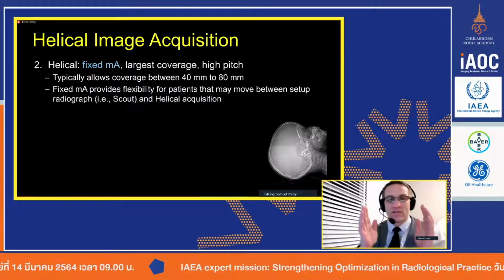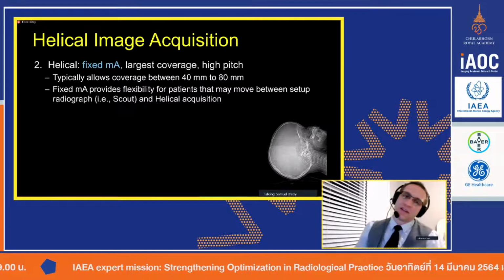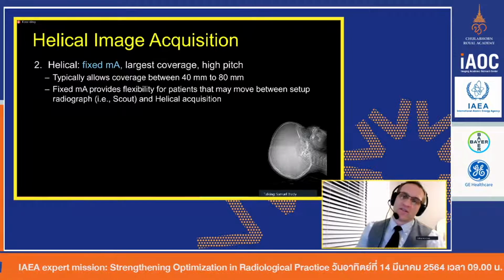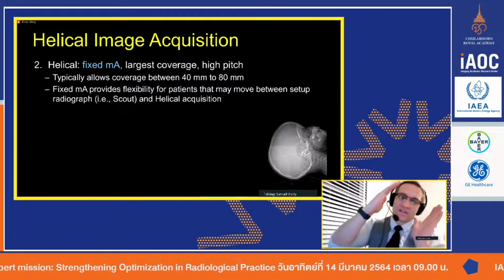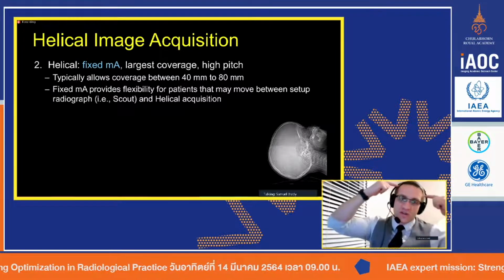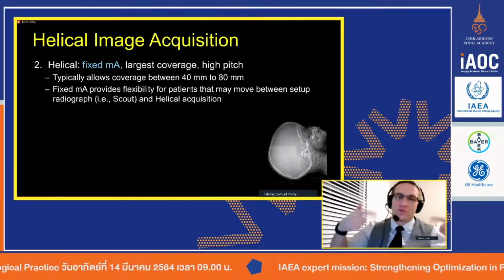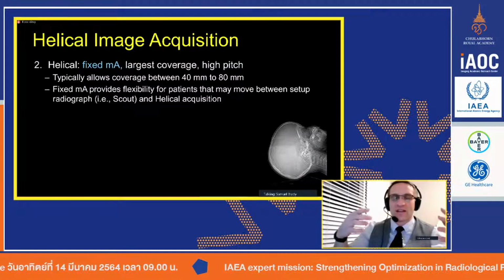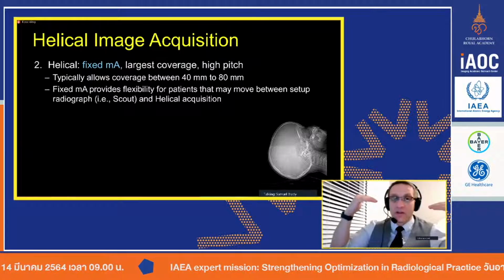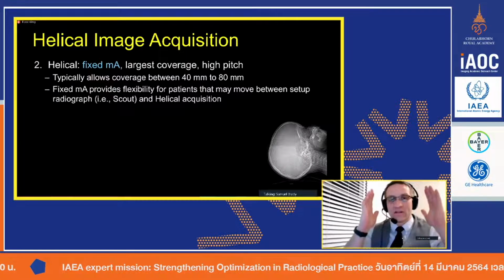And so if the patient lying on the scanning table, his head is not exactly lined straight, well, if it's off on an angle, the scout image is going to show that it's thicker through certain projections. And therefore, when you do tube current modulation, it's actually going to at times calculate for higher MA, instead of a nice, properly centered and aligned head.